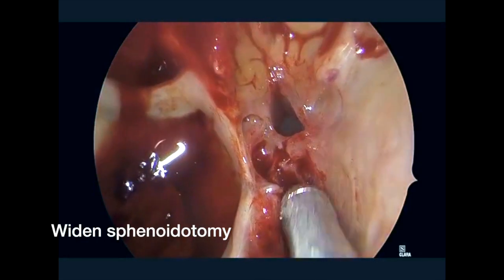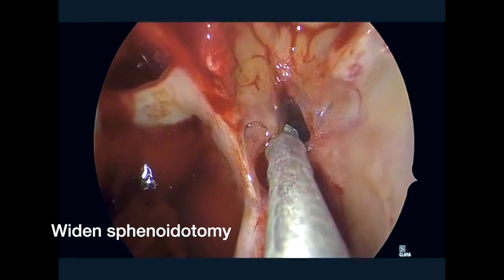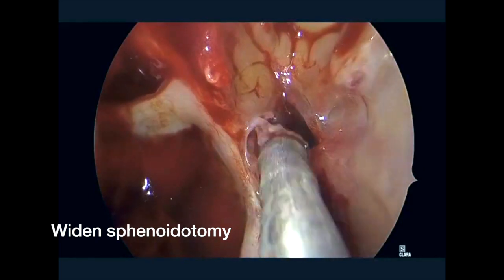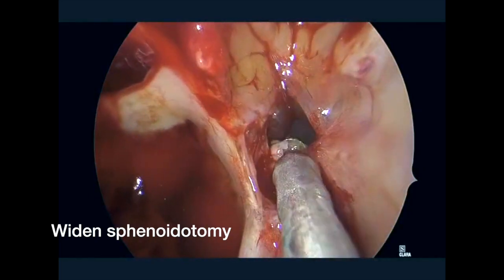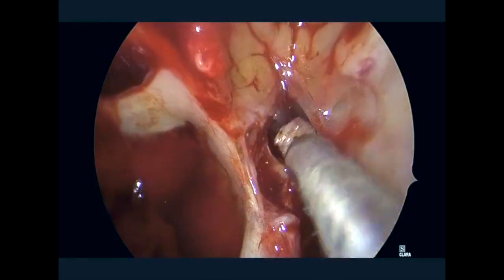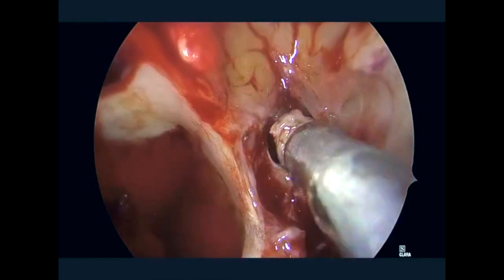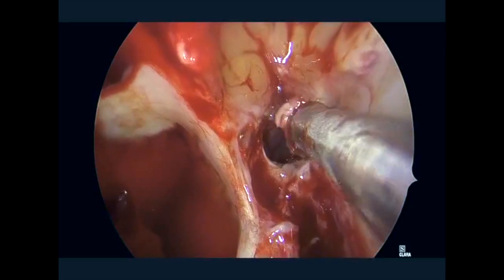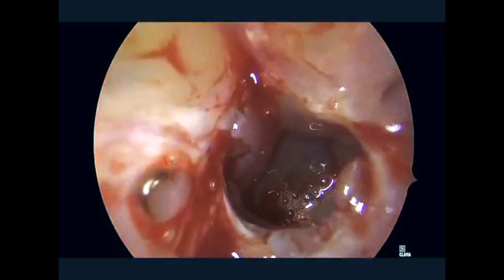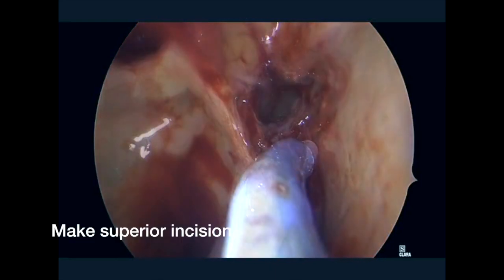We then open the sphenoid in a fairly typical fashion with a straight mushroom punch, removing the previous scar and ensuring a wide sphenoidotomy. As we open this up, you can see the inspissated secretions and infection.